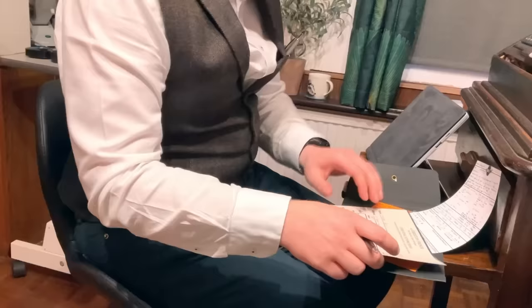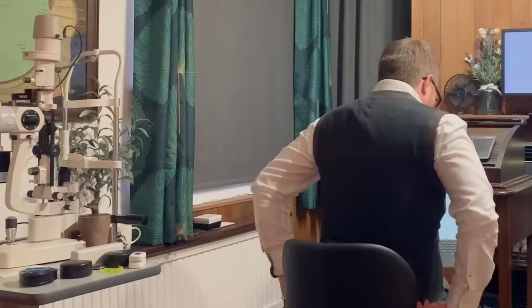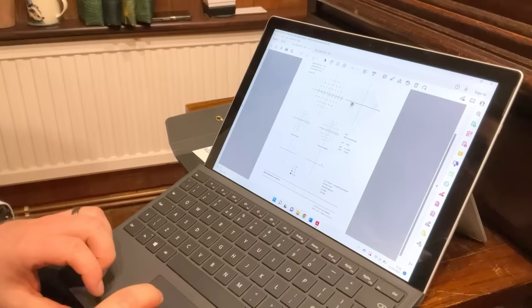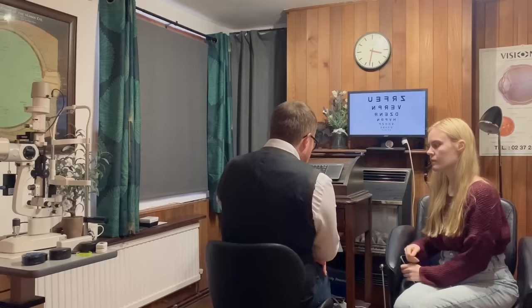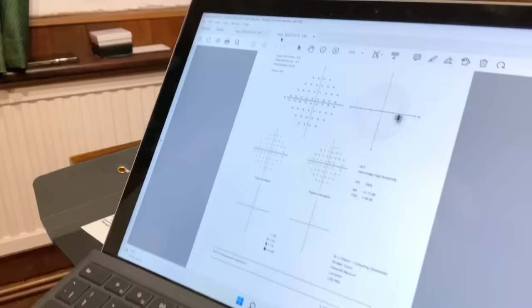So I'll quickly write your prescription up so that you'll be able to take that away with you. Right, okay, so these are your results from your peripheral vision test. We've got your left eye and your right eye. Lots of little data points on there. Essentially it's identifying if there are any areas of reduced sensitivity in the peripheral vision. You'll notice the little black dot there. That's your natural blind spot, so we wouldn't expect any sensitivity there. But looking at the other plots, there are no missing points in your right eye. So that's very good.